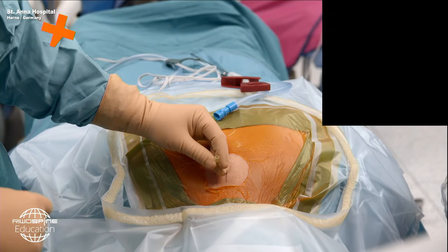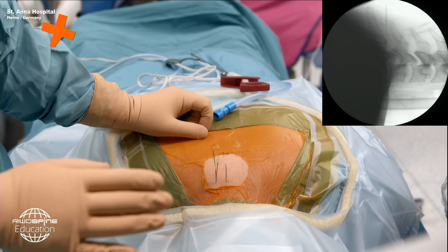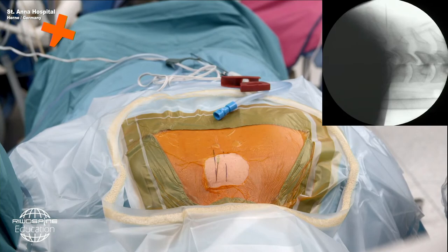And the needle has to be just in direction to the disc that we want to operate. Yeah. So now we check it again.